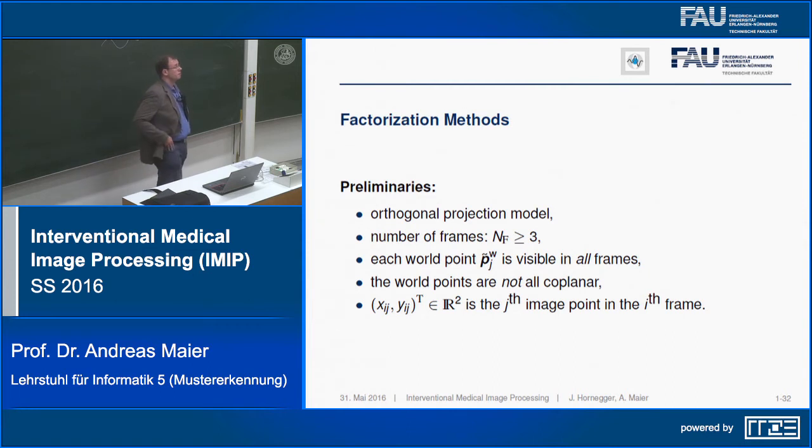Yes? It's just a number of tracked points. So you need, but the tracked points have to be the same in every image. So typically you use markers as the one you've seen previously on the slide. So you have to have points that you can track really well, because if you start confusing points in the tracking, all of your reconstruction will go wrong. And another point is that the world points are not coplanar. So you need something that is really a 3D point cloud. If they are all in one plane, you won't be able to use this algorithm.